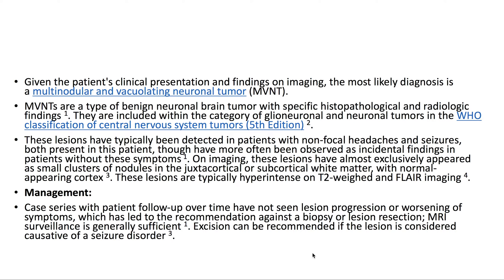Both are present in this patient, although MVNTs have more often been observed as incidental findings in patients without these symptoms. On imaging, these lesions have almost exclusively appeared as small clusters of nodules in the juxtacortical or subcortical white matter with normal appearing cortex. These lesions are typically hyperintense on T2-weighted and FLAIR imaging.